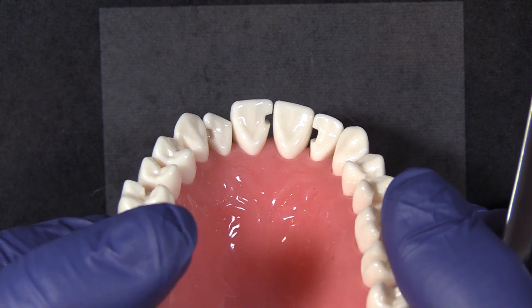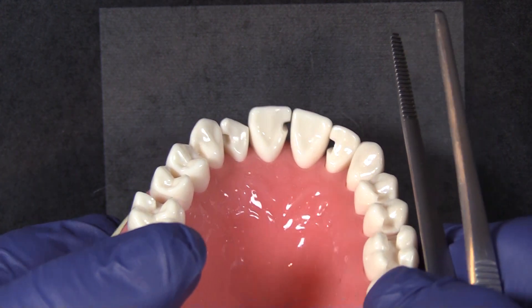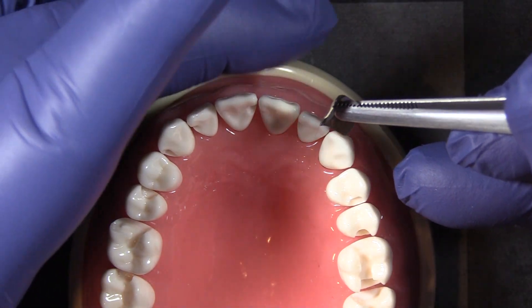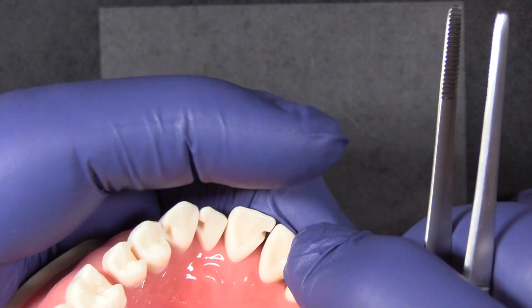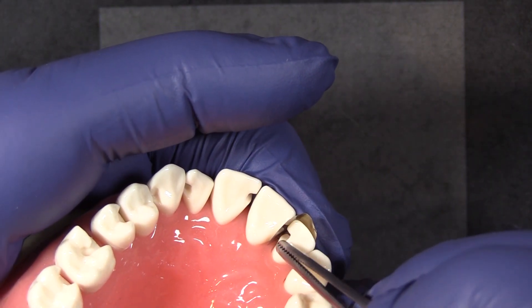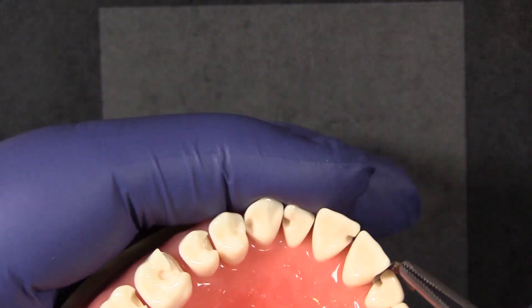On number 10, you see that the restoration is a little bit more towards the gingiva, a little bit farther down the tooth. To allow the matrix band sufficient width to help you with that restoration, I'm going to place it so the wide end is down towards the gingiva. You can see by having the wider portion of the band down towards the gingiva, I've got plenty of matrix band material to work with there.